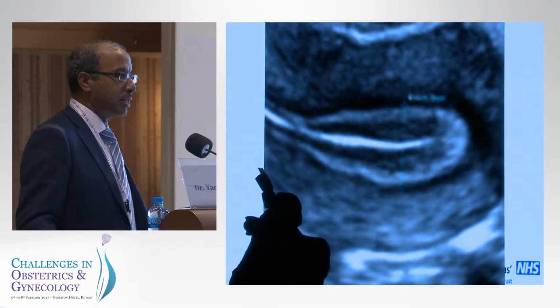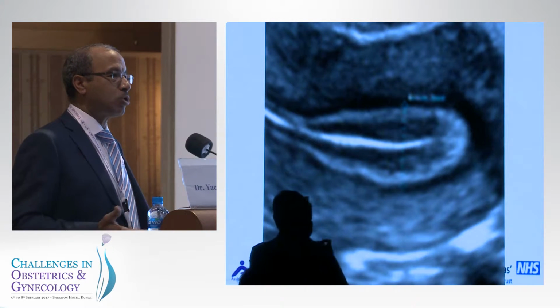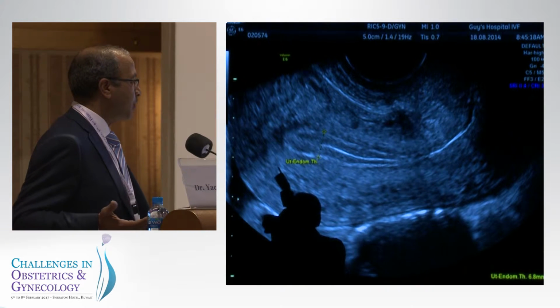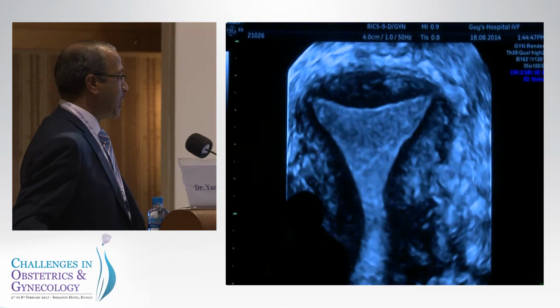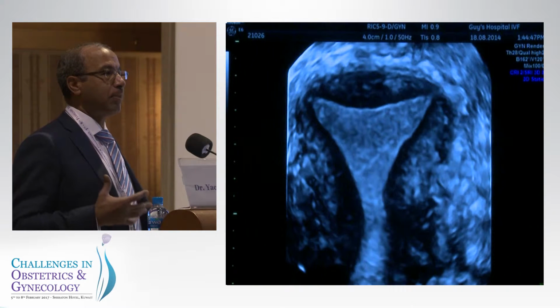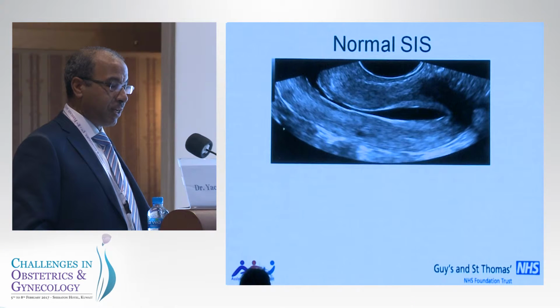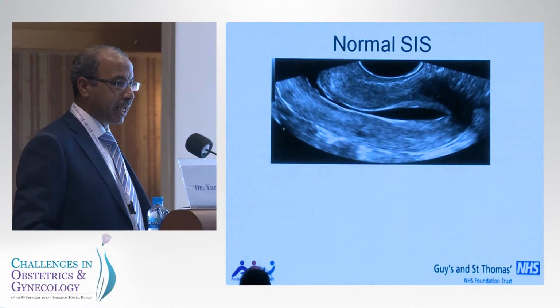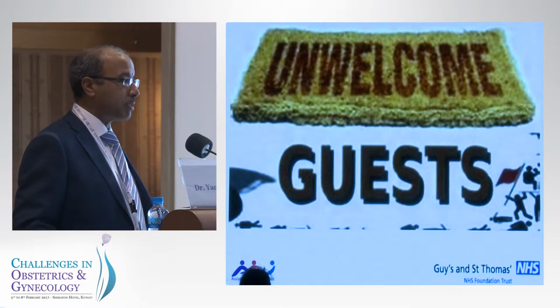And it's very rare that you see a picture like this, where you then find additional pathology over and above what you see in the ultrasound scan. It comes in different ways and shapes, but still with good resolution ultrasound and 3D ultrasound, you can have a fair idea that the endometrium is blameless, and then you can move on to something else. Even if you wanted some clarification, just instilling a little bit of saline inside the cavity of the uterus can give you additional information and reassurance that the cavity is absolutely fine.